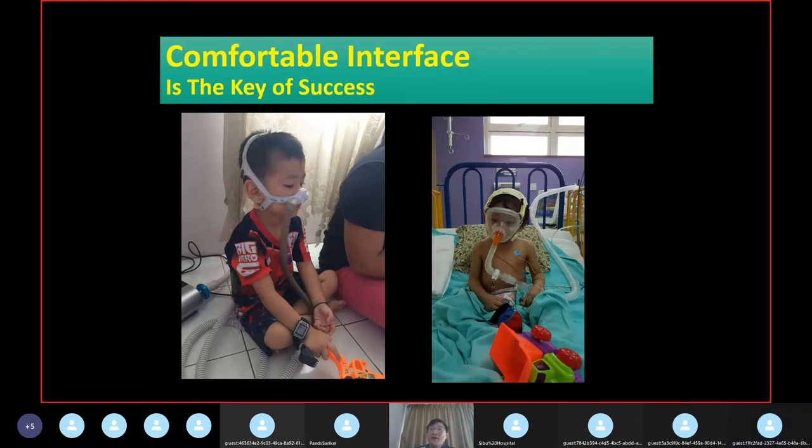So you're going to have things that put in your nose, like you're going to ride a motorbike, that kind of feeling, okay? Or sometimes I'll persuade them by saying, okay, do you dream of becoming a pilot, right? Do you see that the pilot, especially the jet fighter pilot, is using a special mask that is put on their face, okay? Do you want to experience that, or a similar experience to what the pilot did, right?